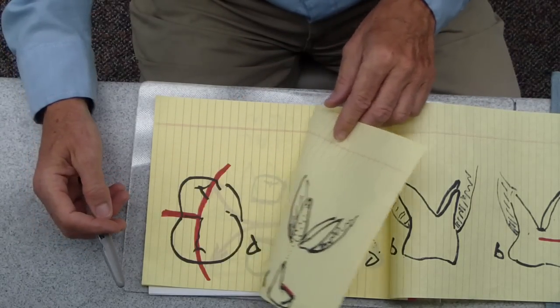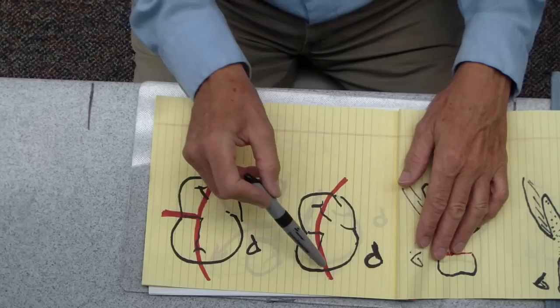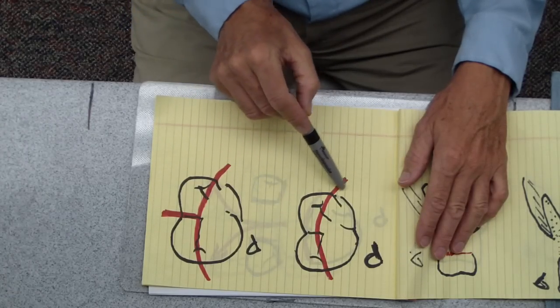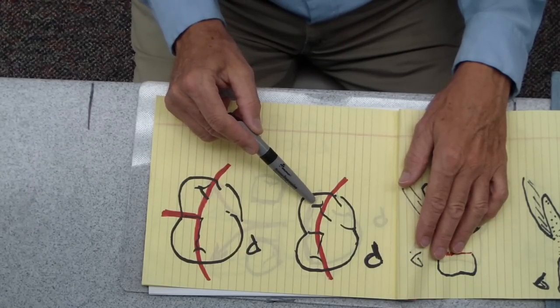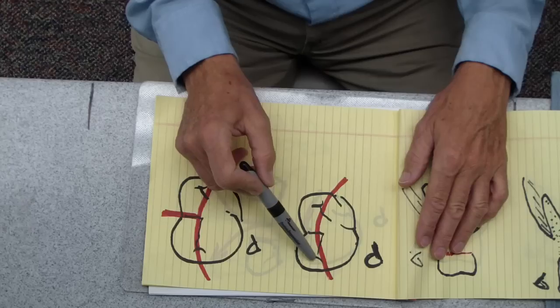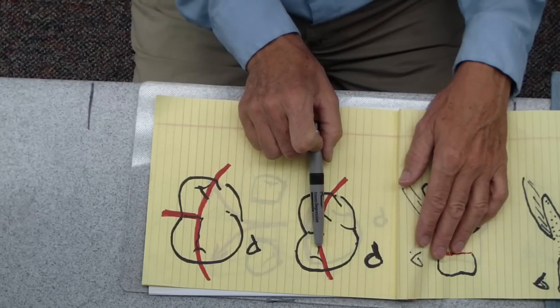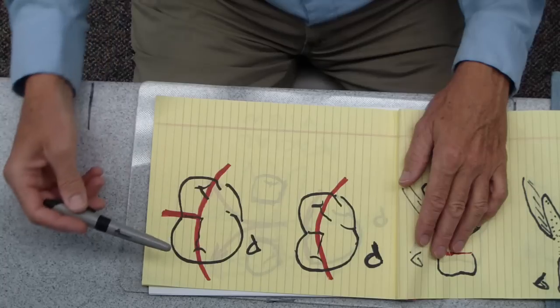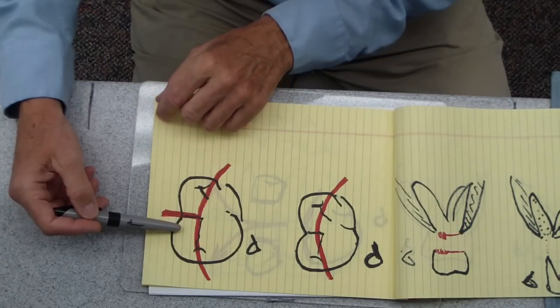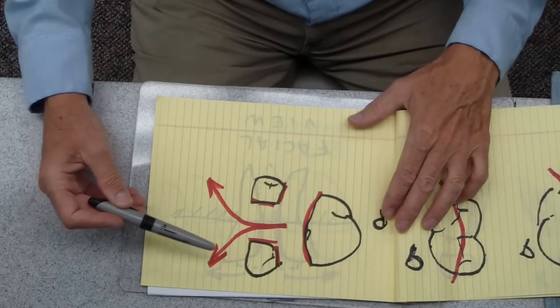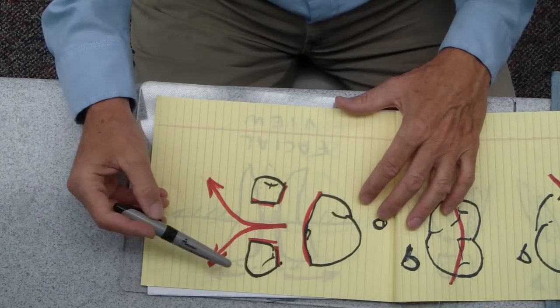I don't like digging out root tips, and basically that's what you're stuck with. I have another technique I use. Looking at it from the occlusal view, I separate the buccal two roots from the palatal root, and instead of going straight across, I do kind of a semi-lunar cut like this. I want to maximize the amount of tooth structure that's left on both the mesial buccal and the distal buccal crown, because they're a little bit fragile. Once I separate the whole buccal half of the tooth from the palatal half, then I'll go ahead and I'll separate the mesial part from the distal part. Once you do that, then it's a pretty easy proposition just to take out.